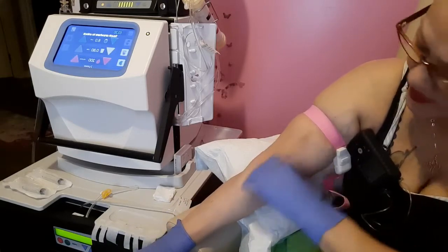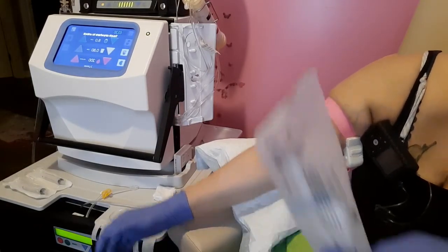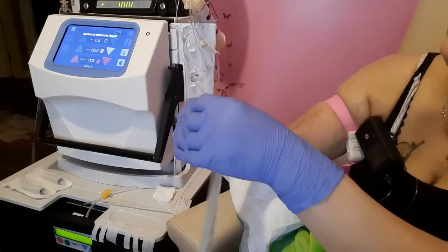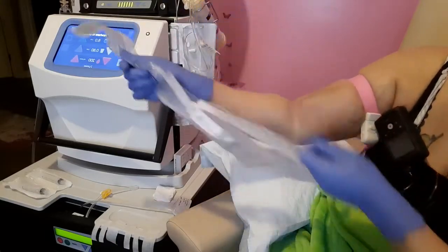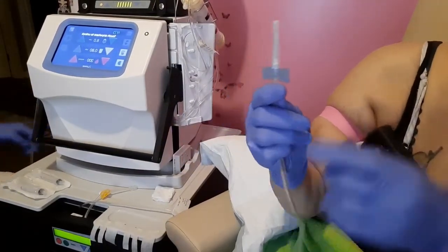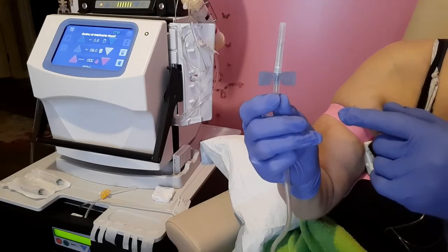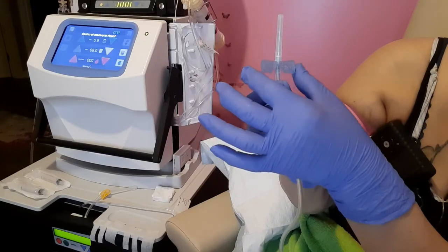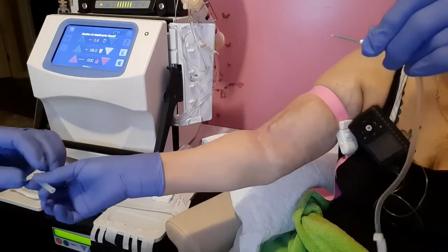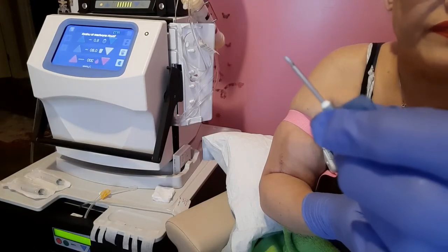Okay, so once you've done that, you grab your syringe. These are 15 gauge needles, okay? Open that up, pull out the needle. It comes with wings, okay? There's a smooth side, and then there's a little embossed side. You want the smooth side. It's got 2 little bars at each end, and you just want to pinch them together, hold it straight across, and pull out the cover. Now, this is sterile, so it can't touch anything. And there's the needle. See? And that tip right there, that's called a bevel.